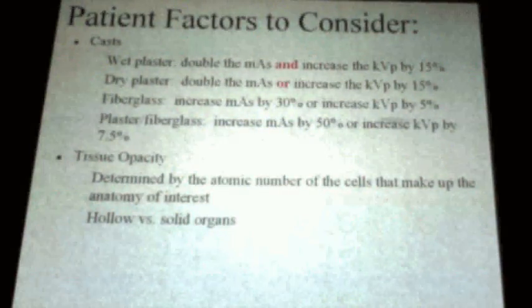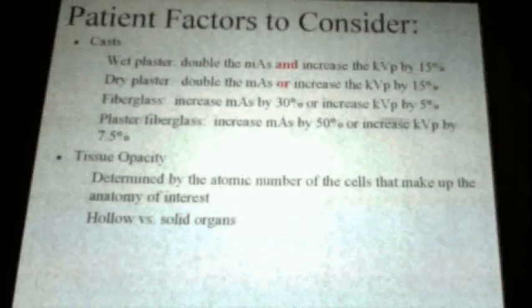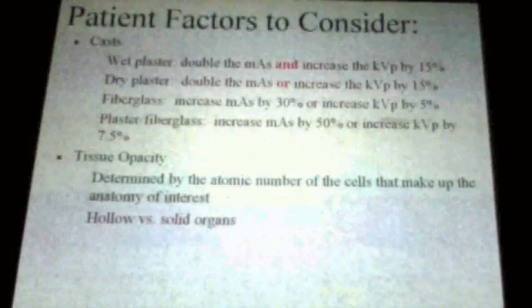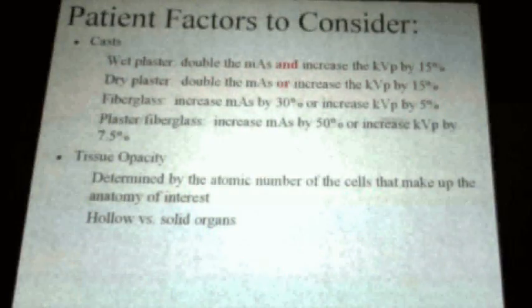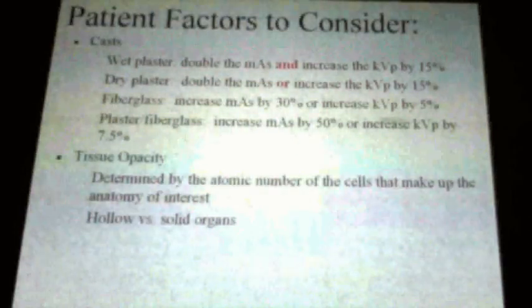What about a solid organ like the liver? What would that look like? Gray. Gray, because that is attenuating the primary beam.